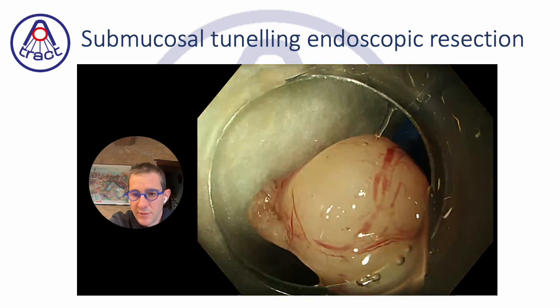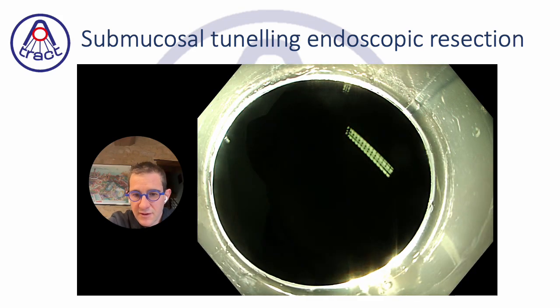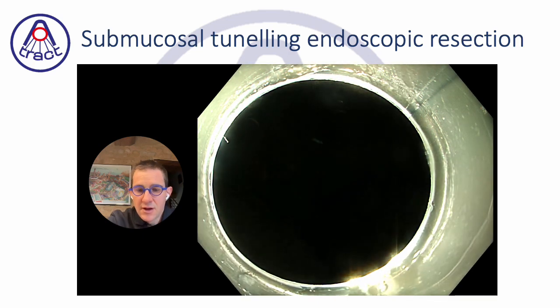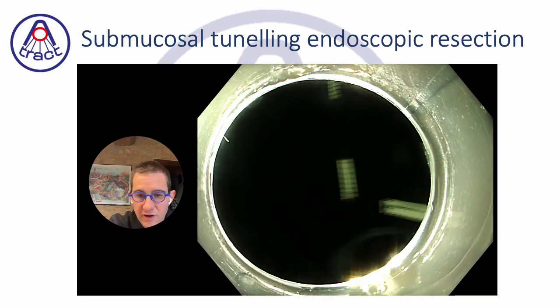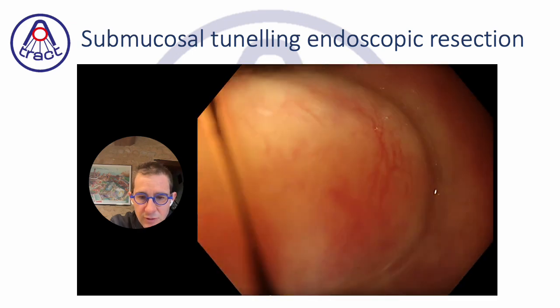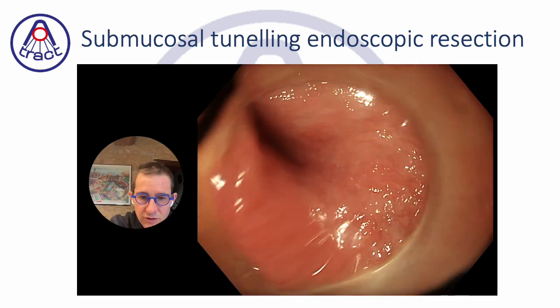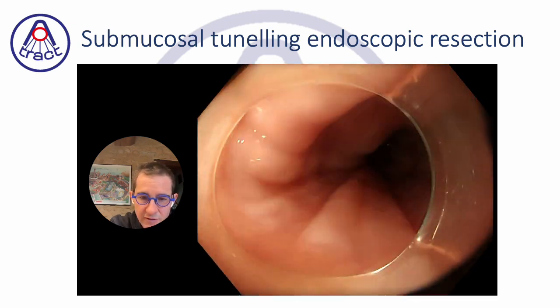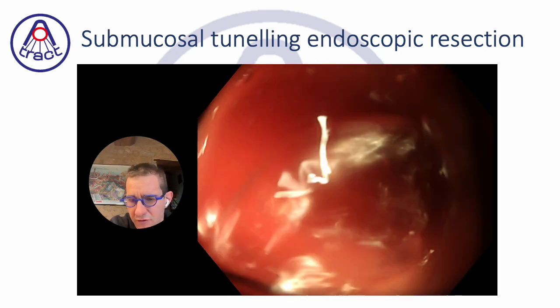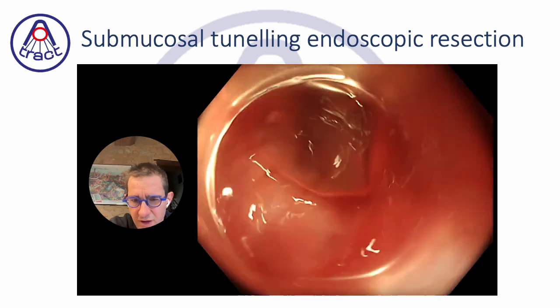Okay, finally we managed to do it. So we have the lesion here, a little more than 1 centimeter, 11 or 12 millimeters. And finally, we used conventional clips to obtain the closure. Three clips were necessary to close the entrance of the tunnel, which was, I think, 2 or 3 centimeters above the cardia.